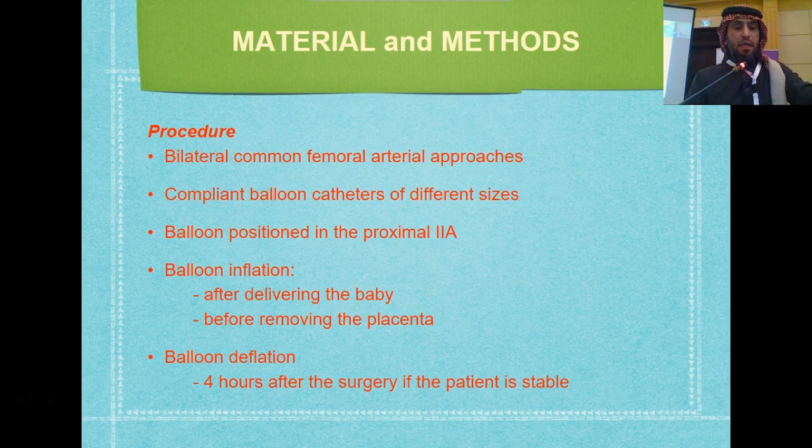So as I mentioned, we puncture both femoral arteries. We use a compliant balloon, very safe, a special balloon that we are using. We try to put the deflated balloon in the proximal internal iliac artery. The recommendation is we inflate the balloon.